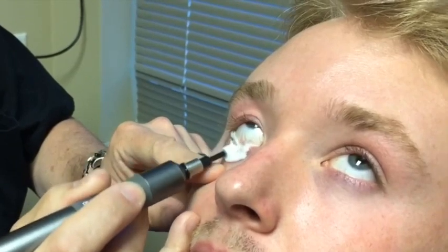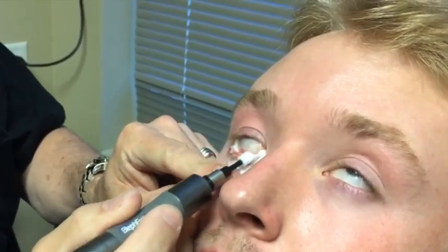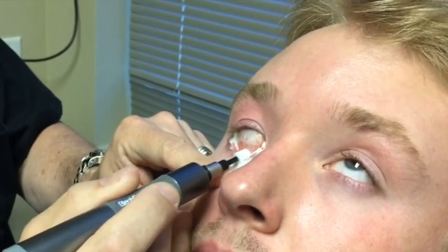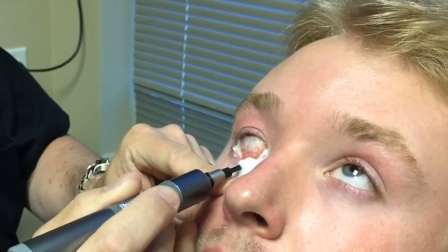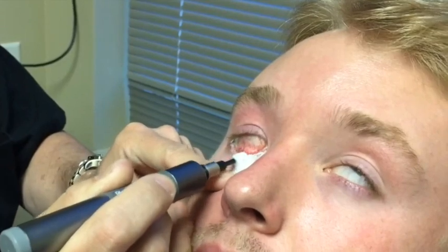Now I can't emphasize enough how important it is to use a nice firm pressure in treating these eyelids. I'm treating rather aggressively. As you can see, you should see the lid margin pushing away from you with the force that you're using, and almost stop the motor like that. If you push too hard, it just stops. That's the force you want to use. So it's just starting to slow down that motor.